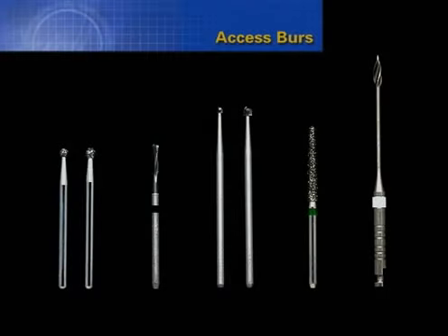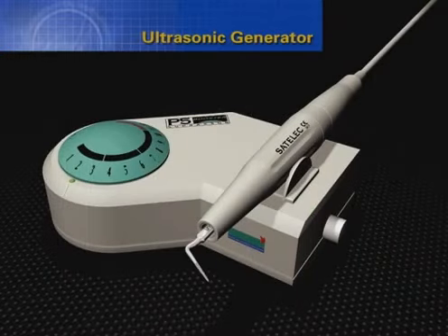In endodontic retreatment, the clinician will require a number of rotary cutting burrs. In particular, the surgical length burrs move the head of the handpiece away from the occlusal table and provide unsurpassed vision when chasing missed canals. The P5 piezoelectric ultrasonic unit provides unmatched power when performing endodontic treatment and retreatment procedures.